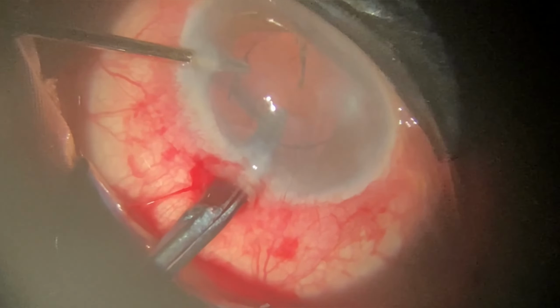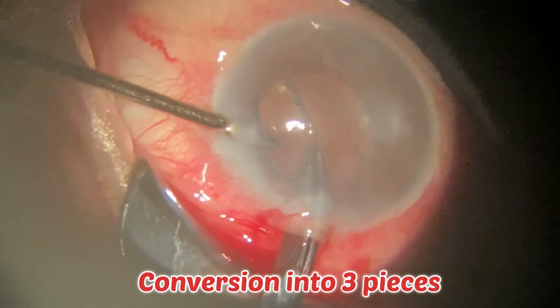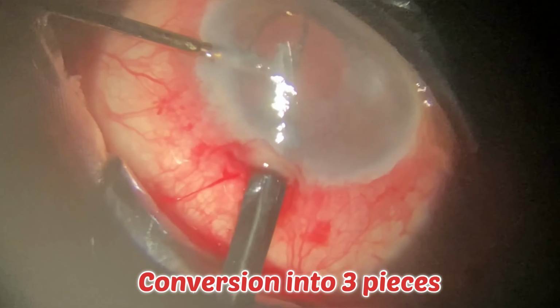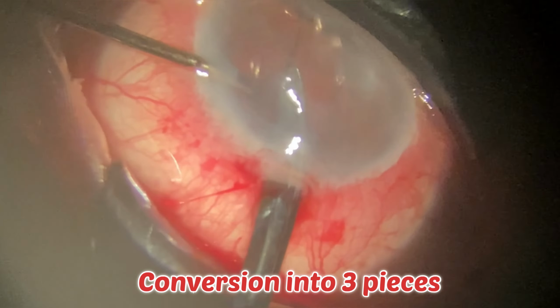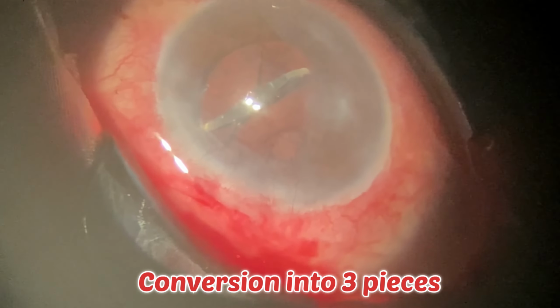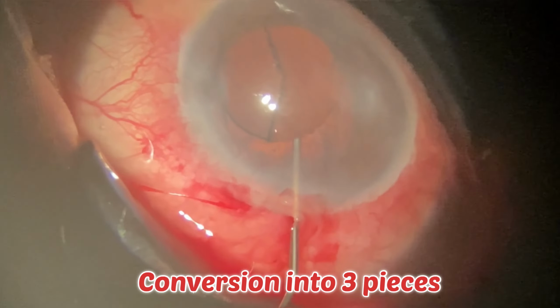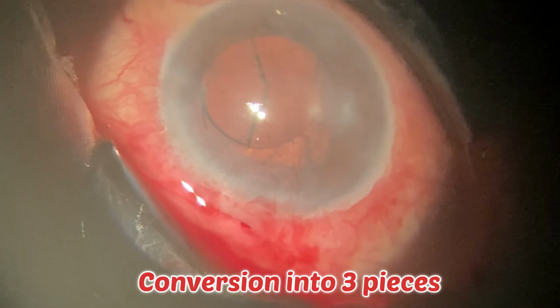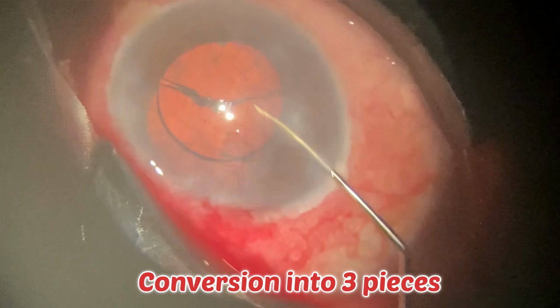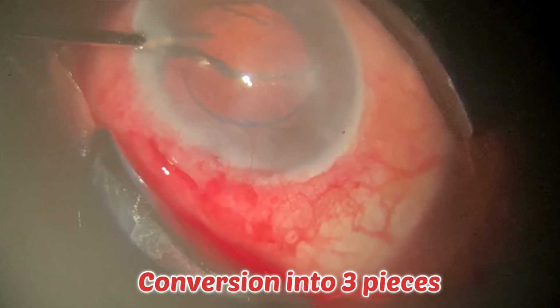Now, after rotating the intraocular lens clockwise, I am holding it again with the micro forceps in my left hand and cutting the intraocular lens till the center of the IOL with the help of a curved scissor, like this. Applying some viscoelastic solution to the IOL so that endothelial injury will be reduced. And now rotating the intraocular lens clockwise again and making it ready for the last incision of the Y incision.